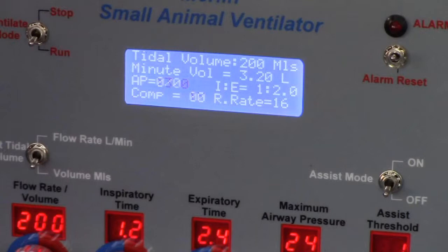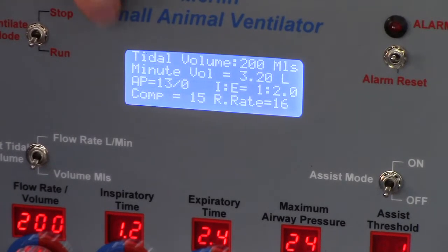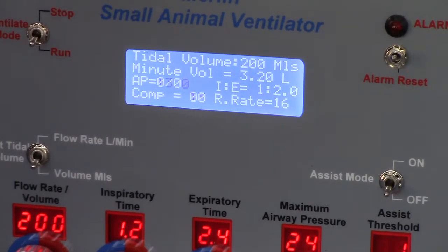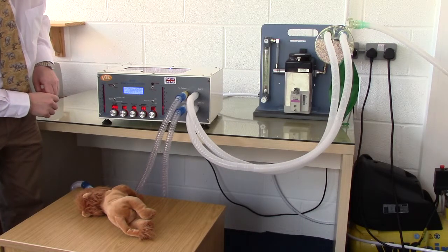We can see that the IE ratio is set to 1 to 2. And watch the airway pressure as it rises up to 13 during each breath. And notice the chest movements of the patient as it is ventilated.